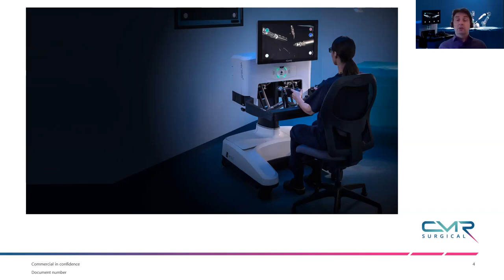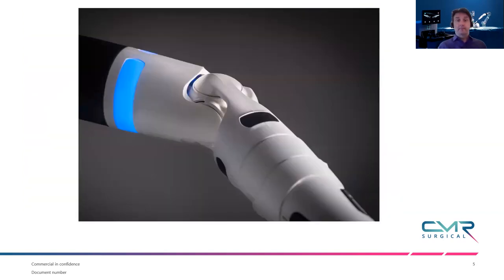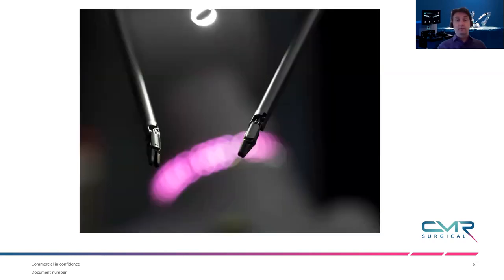With this approach, the surgeon can sit comfortably with their arms rested and relaxed down at their sides, or they can change the position, and this whole part of the open console can move up hydraulically, so that it is at a level where the surgeon could stand and operate. This is just showing you one of the movements at the wrist, and we'll see in the video how much movement you can get out of this sort of approach.